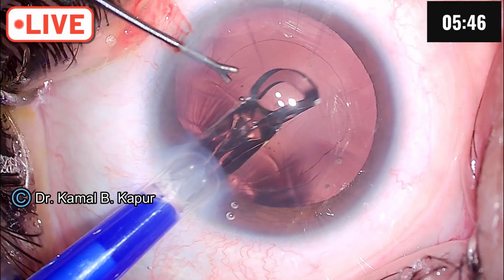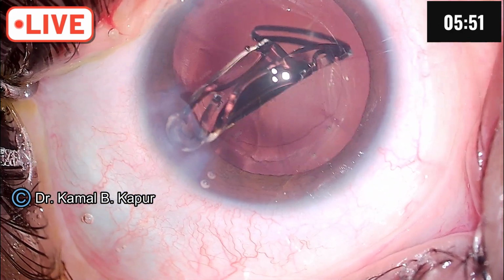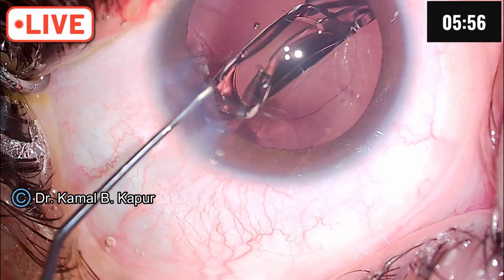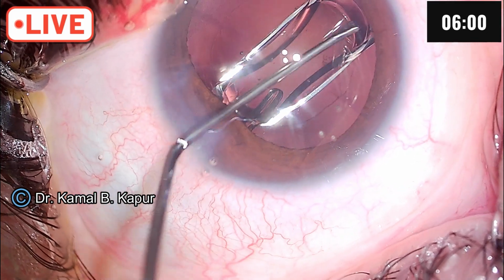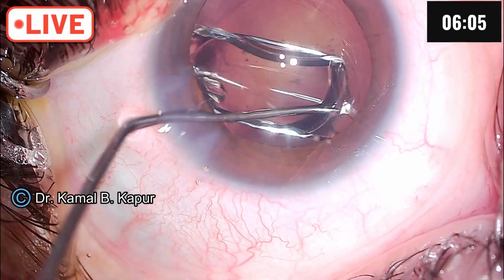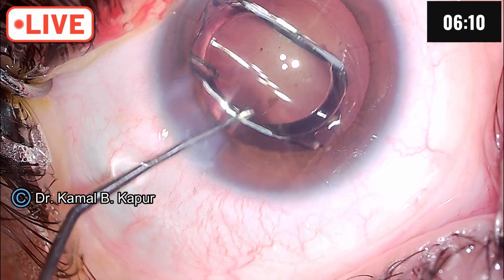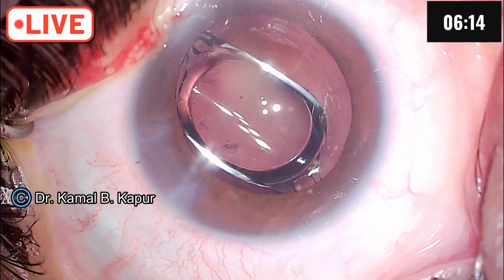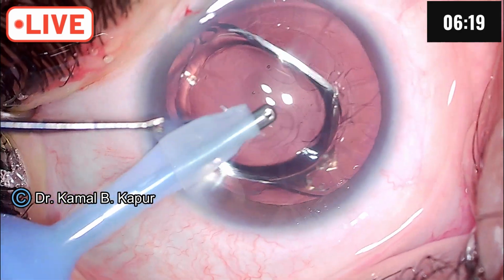My choice of lens in such cases is an IOL with rigid haptics, which tends to get locked in the bag. Most of the patients will have very deep anterior chambers in such situations because of previous high myopia. And we can see the lens is centering beautifully. Surgery is over.